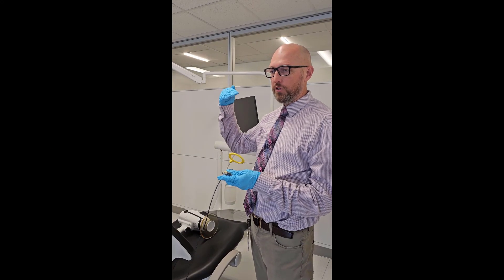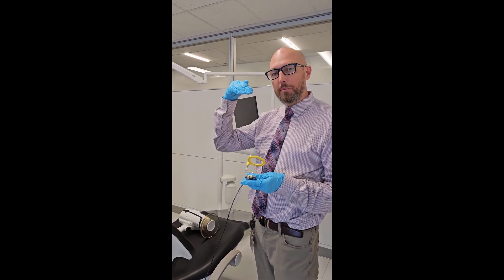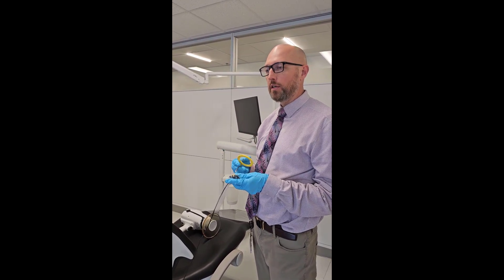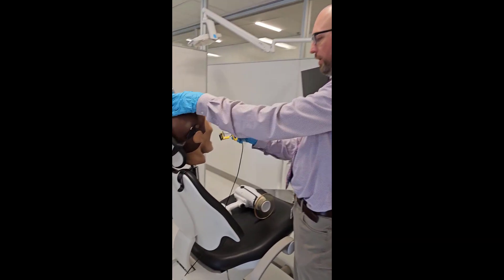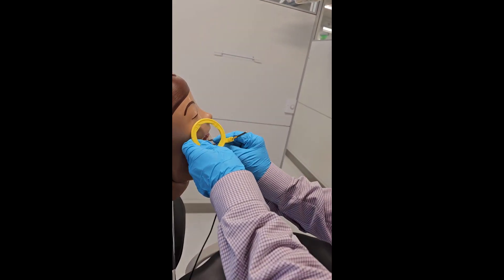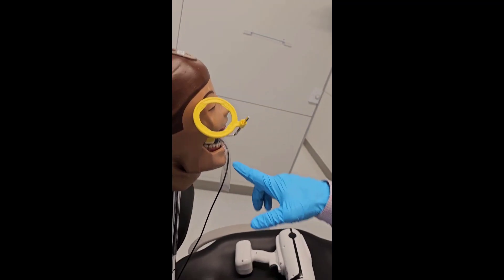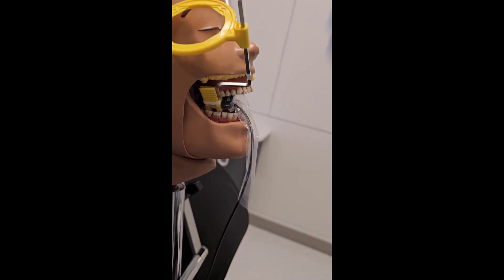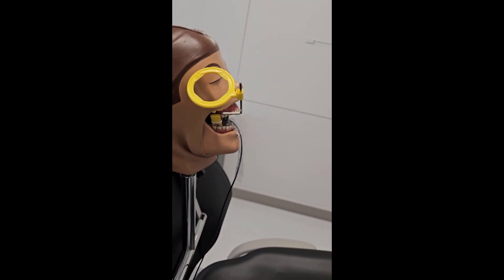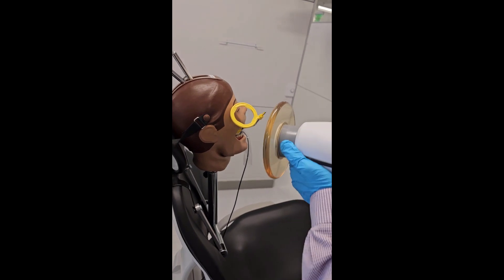It seems like a lot of students will come really far from above for maxillary periapicals just to make sure they capture the apices, but it's so foreshortened and you kind of skew the whole image, making it difficult to interpret. What looks like is happening is students are putting the sensor in at a really steep angle, almost like an occlusal. See how he's not really biting on the bite tab — this will help capture the apices, but it's not the best angulation and it's harder to diagnose. We'll show you what that looks like in this mannequin.